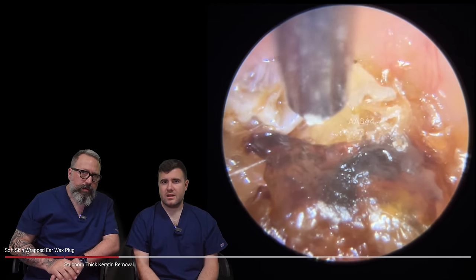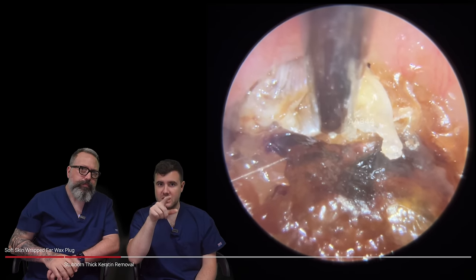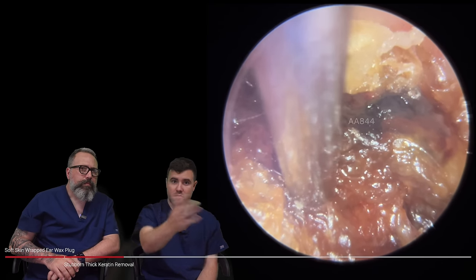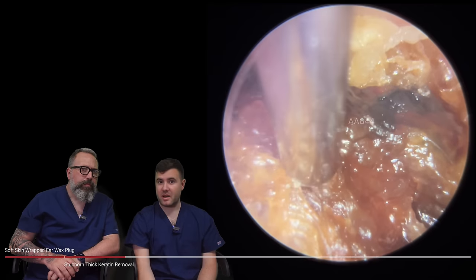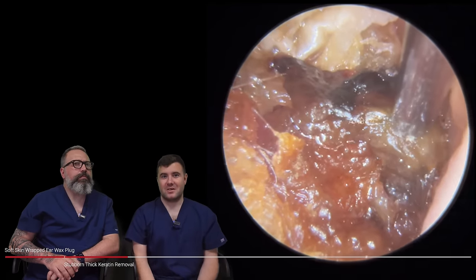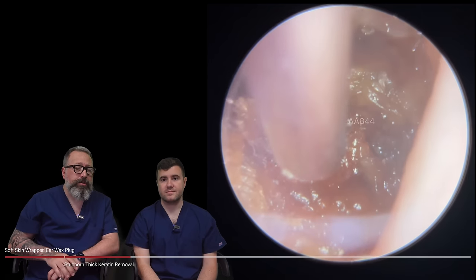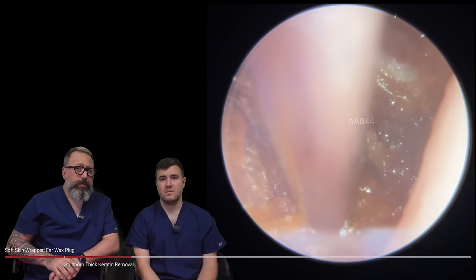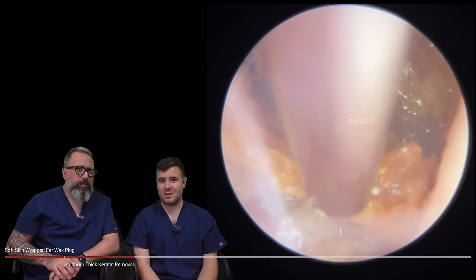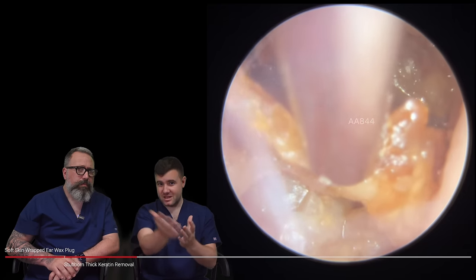I've swapped down to the fine end here just to be a little bit more precise with these bits, because the standard tube wasn't really getting a grip. You can kind of see where we've tried to remove this — I've lifted it but it just sits itself back into the same position. So we've got a bit of a fight on our hands here. It's difficult with that keratin skin because it's so hard it just wants to return back to position. You can see it's really frustrating — we start to move it, we're lifting it, and you can see it's actually detached here.